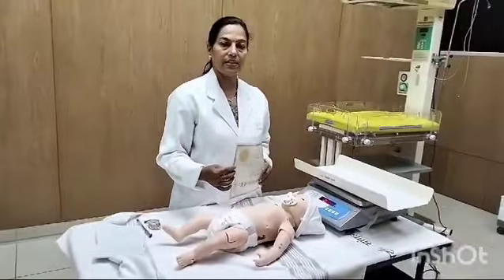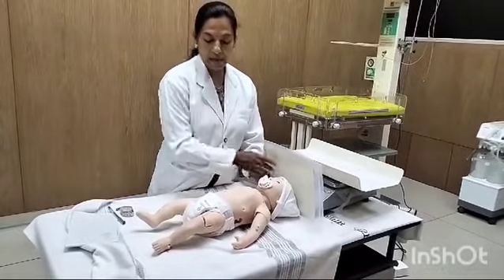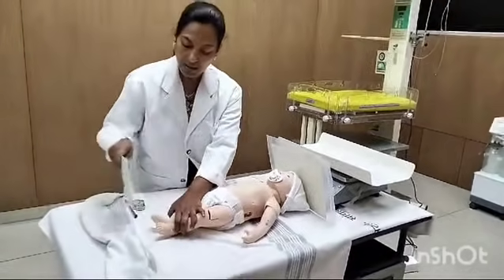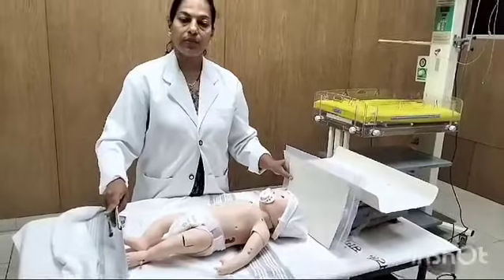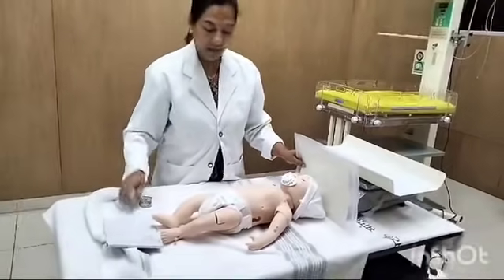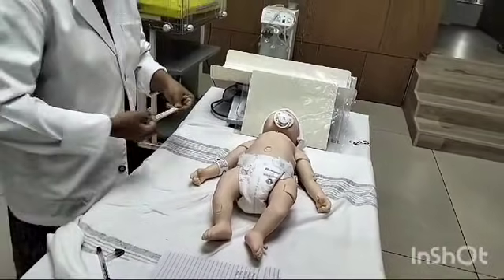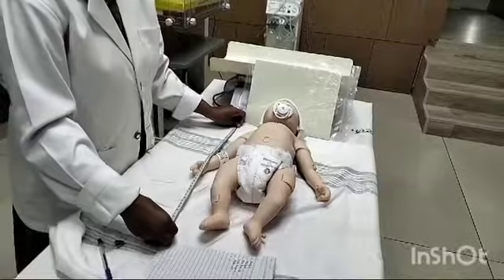If you have an infantometer, you can directly measure on the infantometer. But if you don't have one and there are two persons, place one firm surface above the head, straighten the baby's legs, and place another firm surface at the feet. Measure the height between the two firm surfaces. If there is nobody along with you, you can mark the points and then measure the height of the baby.